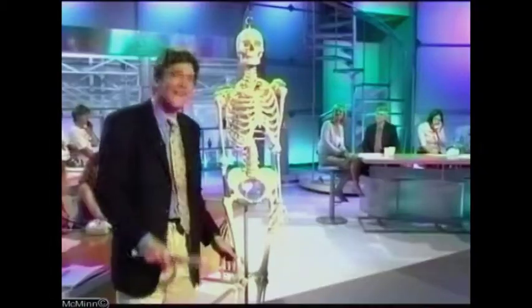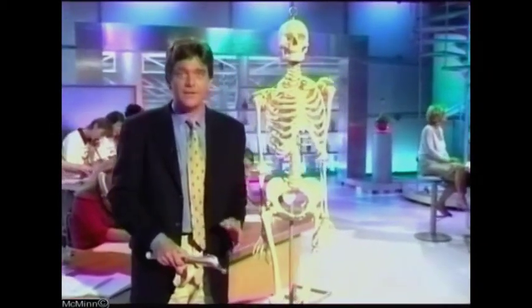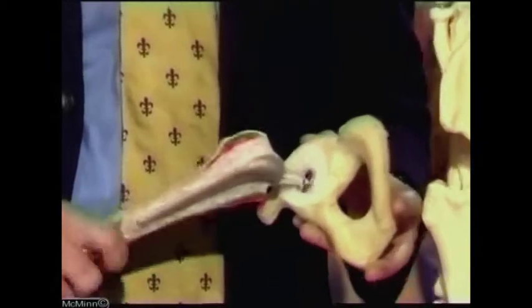Finer. Every year, more than 40,000 people in Britain have hip replacement surgery. It's the final option for people who have diseased or worn-out hip joints. As my friend here demonstrates, a good hip joint is essential for mobility. This is usually what replaces a worn-out hip: a plastic socket in the pelvis and a metal ball cemented into the femur. The problem is that the plastic cup can wear out.